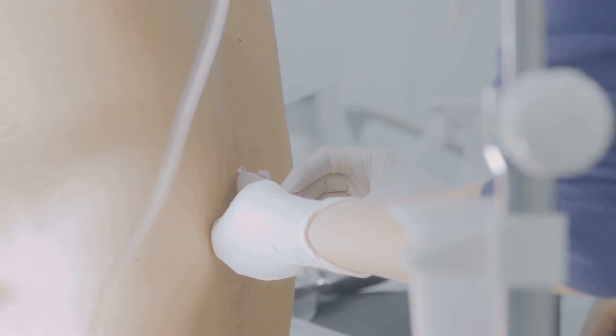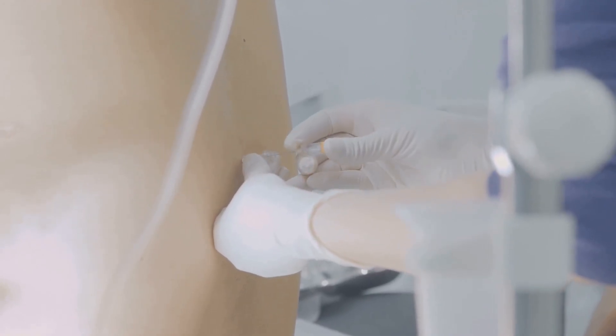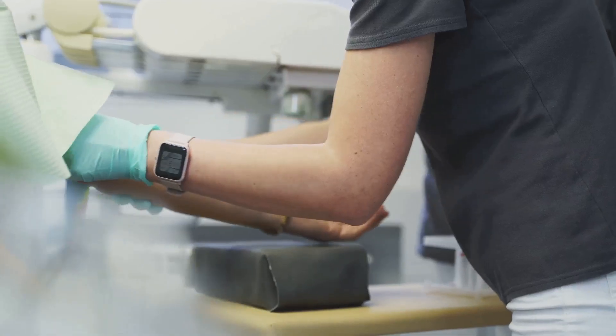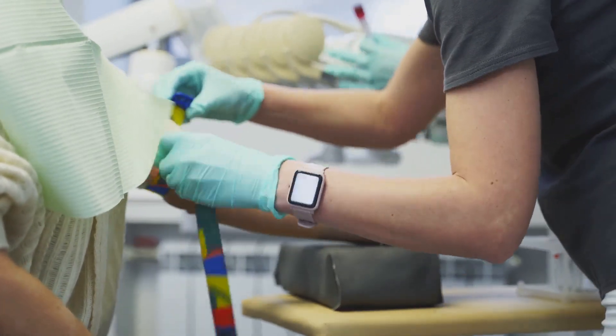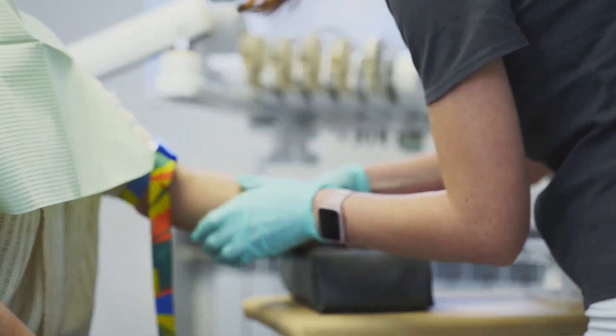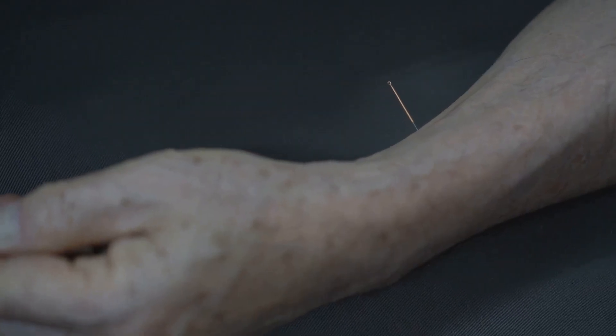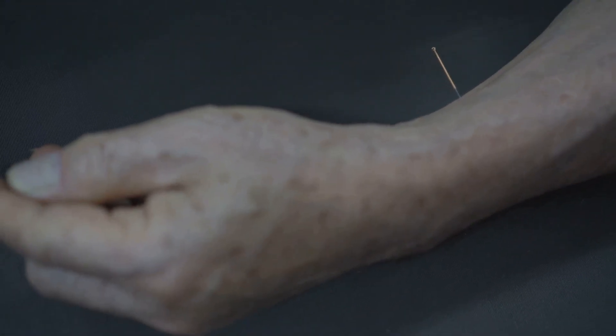First, locate a suitable vein. Take your time and assess both arms, as some veins are easier to access than others. Apply the tourniquet above the elbow and ask the patient to clench their fist. This helps the veins become more prominent and easier to find. Look for a bouncy, prominent vein on the back of the hand or forearm.